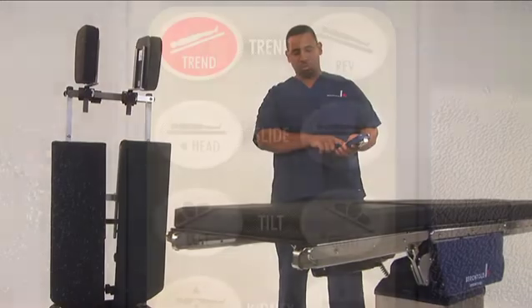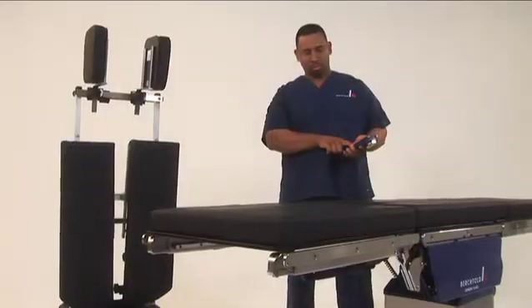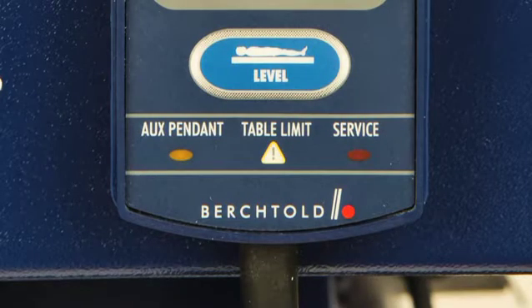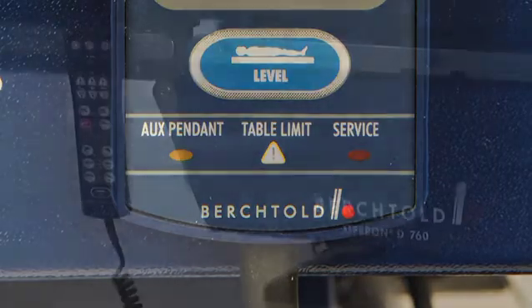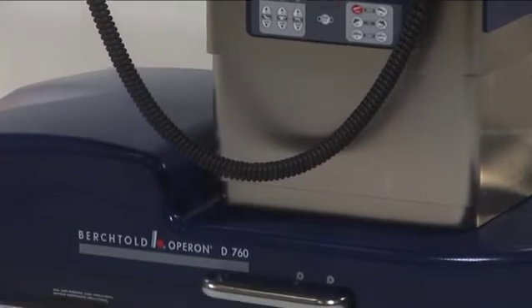Prior to attaching the split legs, use the slide key on the hand pendant to move the table to the foot end of the bed. When the limit sensor light is blinking, the table has reached the slide limit. This is not necessary when attaching the split leg assembly to the D760.